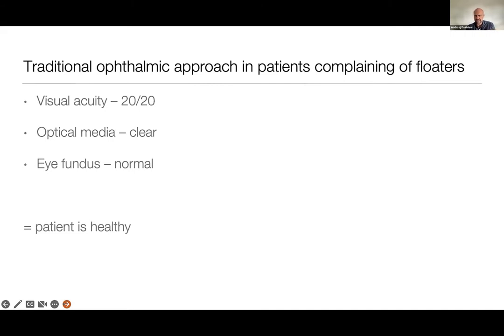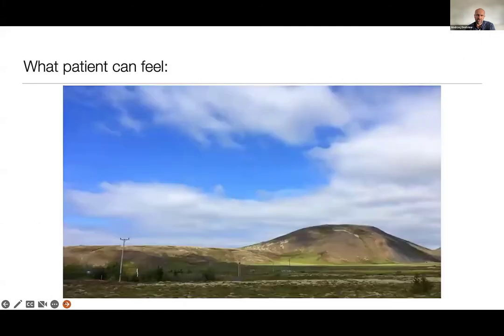But I guess the best method to show the real quality of life is what Paul is going to show. I mean, aberrometry, which is a perfect and unbelievable tool, which gave us a pretty good overview of why patients are complaining so much of visual disturbances and poor visual quality.